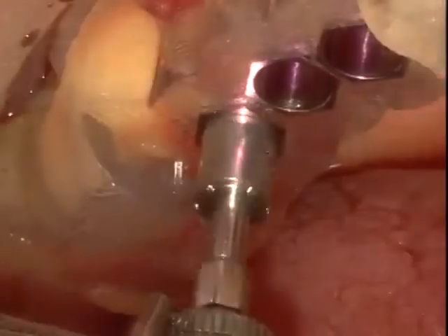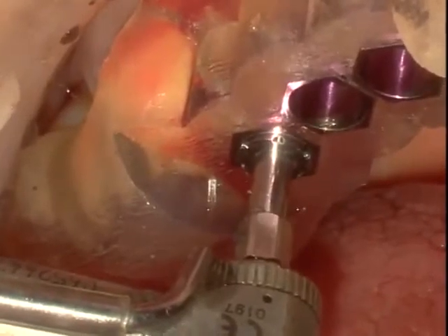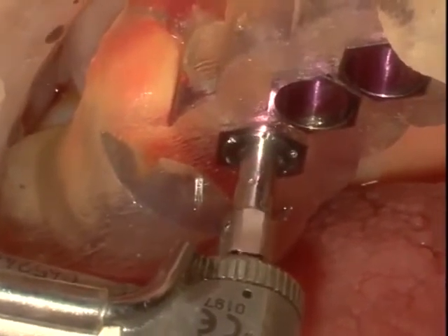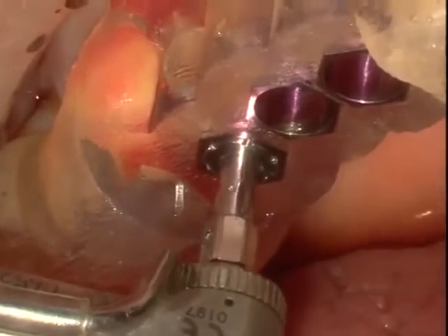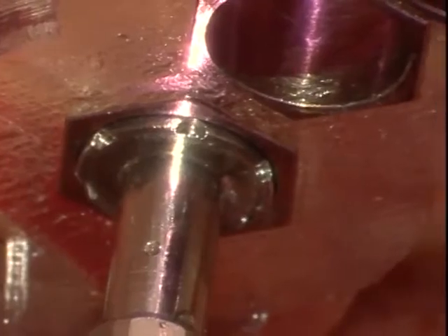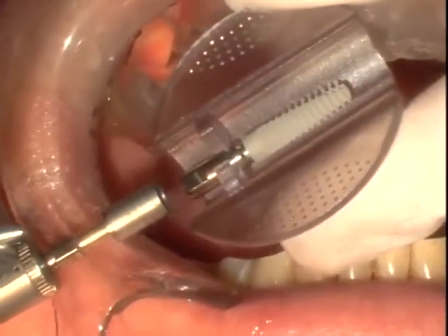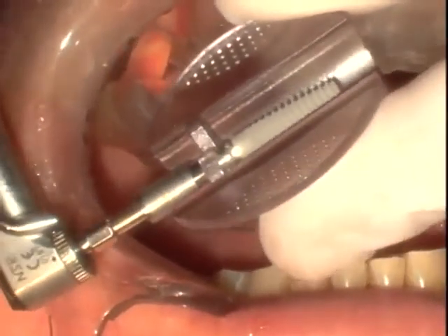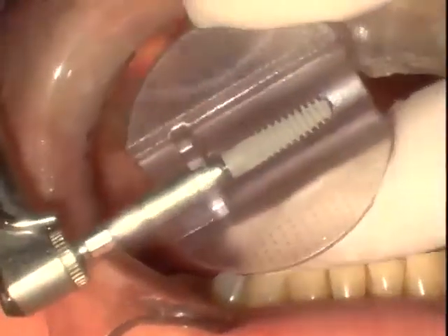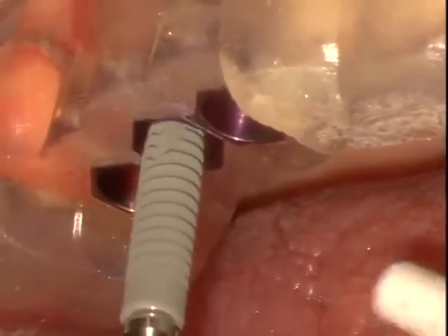And the same way that we place the drills, a sleeve is allowed in the Expertise kit that precisely places the implant all the way down in 3 dimensions, including a vertical stop, which is extremely important to the final success of the restoration. And what you're seeing on high magnification is the precision of the placement, not only, as I said before, horizontally, but also vertically and mesiodistally. The second implant now in the area of the first bicuspid is inserted, again, in the edentulous area, previously edentulous span.